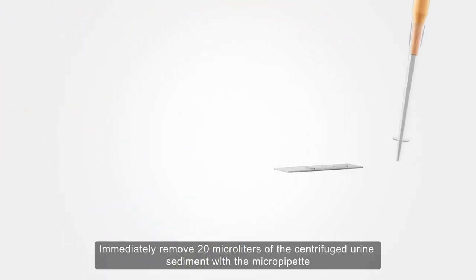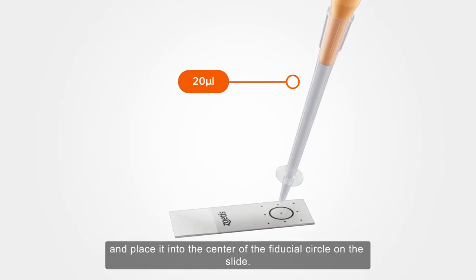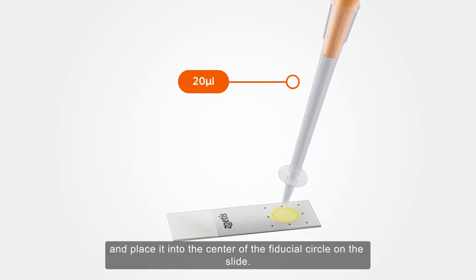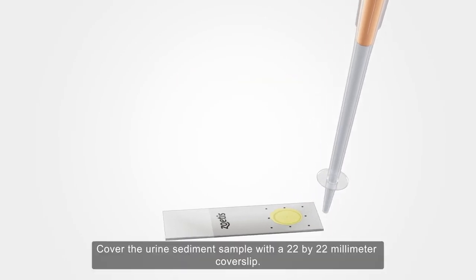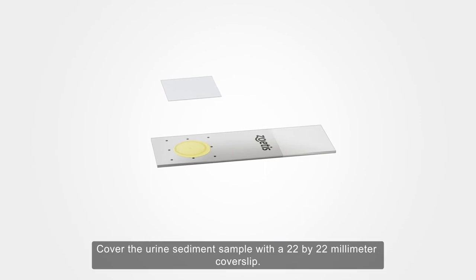Immediately remove 20 microlitres of the centrifuged urine sediment with the micropipette and place it into the centre of the fiducial circle on the slide. Cover the urine sediment sample with a 22 by 22 millimetre coverslip.